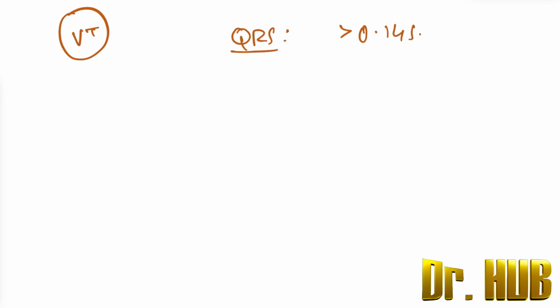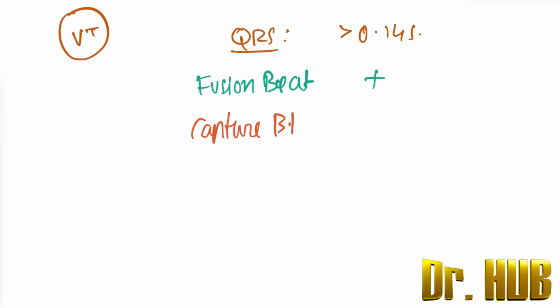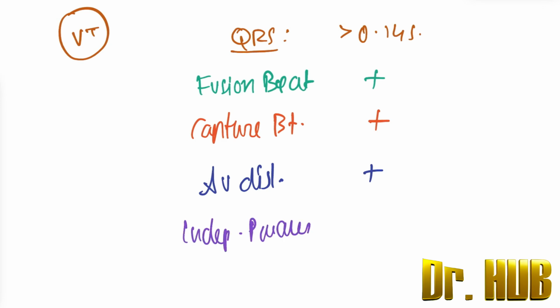Next, the fusion beats. Is there presence of fusion beats? The answer is yes, fusion beats are present. Next, the capture beats. Capture beats are again positive. The AV dissociation is again positive. Then independent P waves. Does it have independent P waves? The answer is positive.